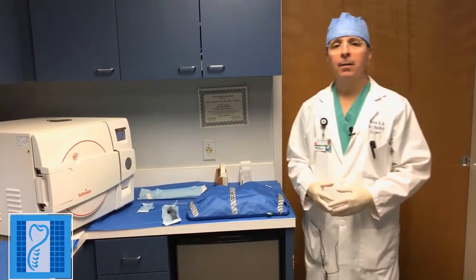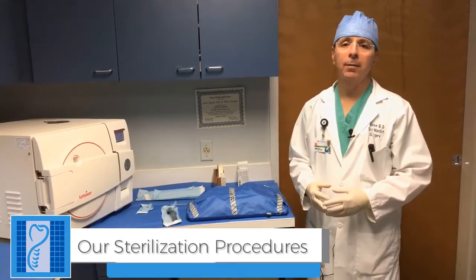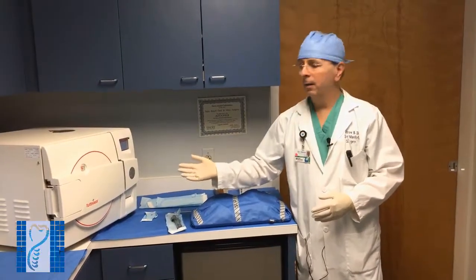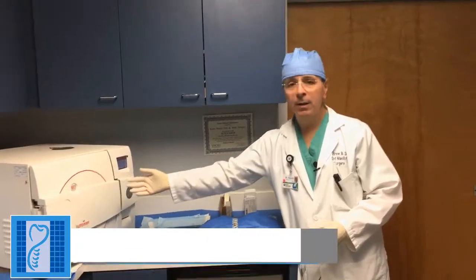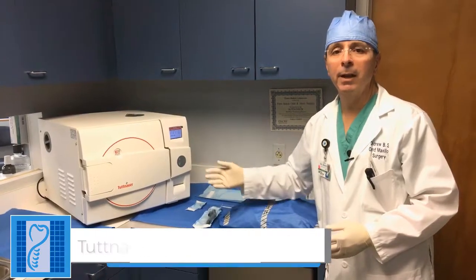I'm Dr. Andrew Slavin, oral and maxillofacial surgeon, and I would like to discuss sterility in our oral and maxillofacial surgery office and what makes us different. This is our sterilization area and we have a Tuttenauer EZ11 Plus sterilizer, which is a steam sterilizer that ensures the utmost sterility of our instruments for our patients.